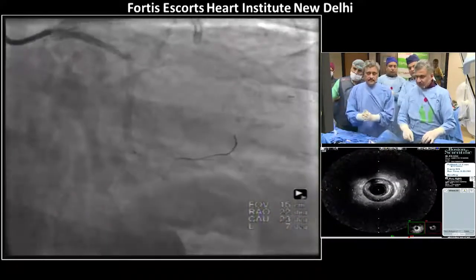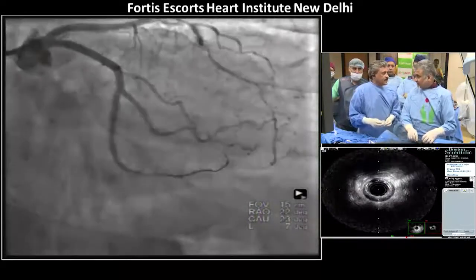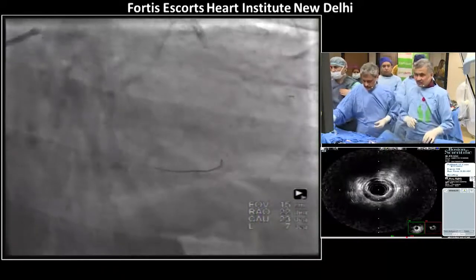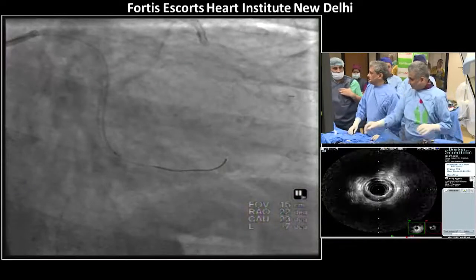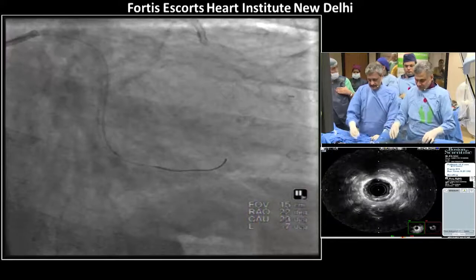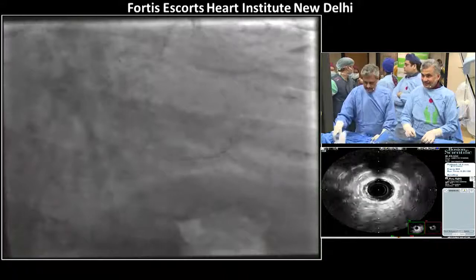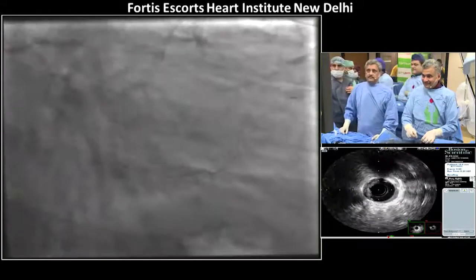What about the ratio between benefit and risk? We have the laser in the lab. You've already spent a lot. I don't know how much time it would take to set it up, or whether the laser will work. As you were saying, I call it quits here. Let's get out of dodge, and this patient will come back. I'll have a controlled infarction, and pain management.